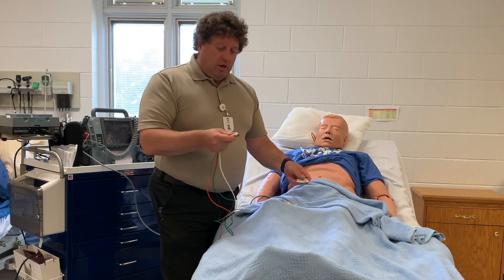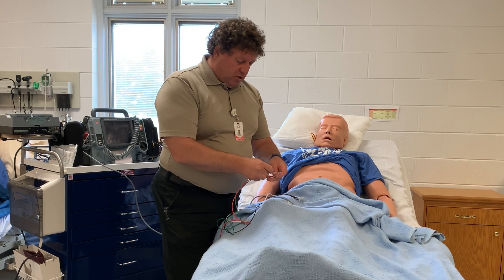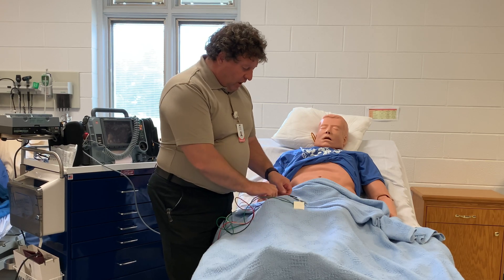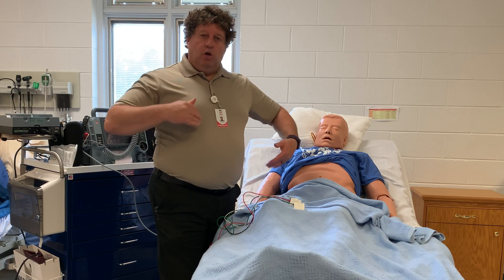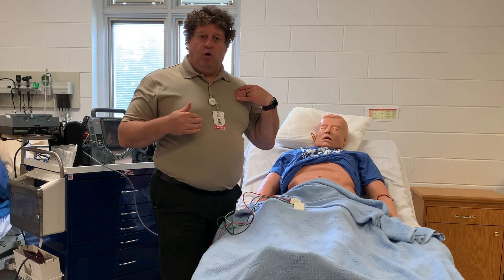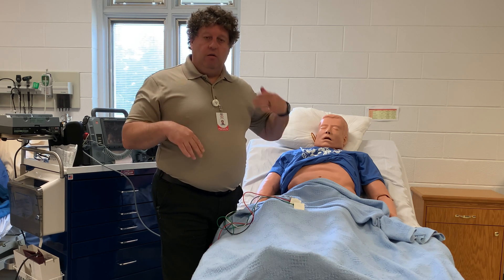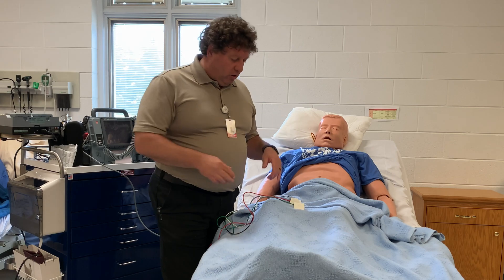I like to attach my electrodes to the wires before putting them on the patient so I'm not pressing too hard. When I was learning this as an EMT, I learned white to right, red to ribs, black was left over because we didn't have the green. So I always remember white, red, black. Then when they added the green, that was the fourth one, and that just kind of worked for me.